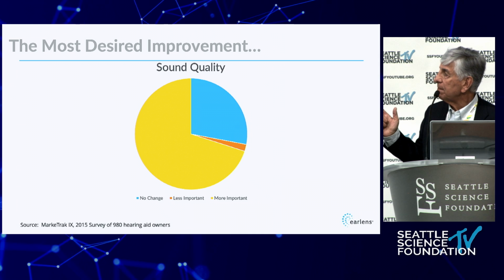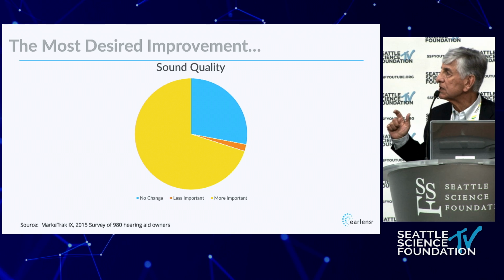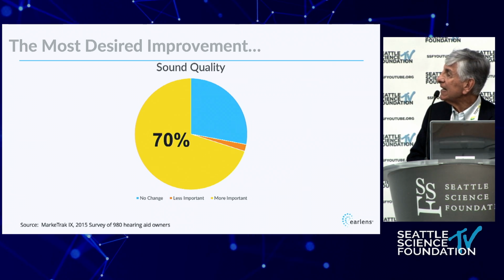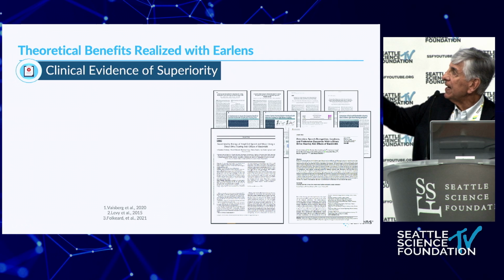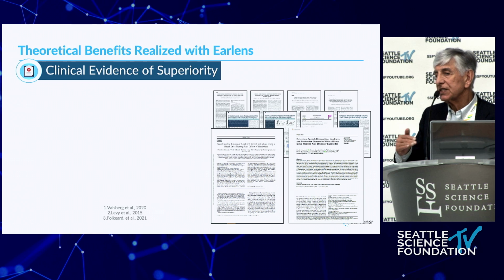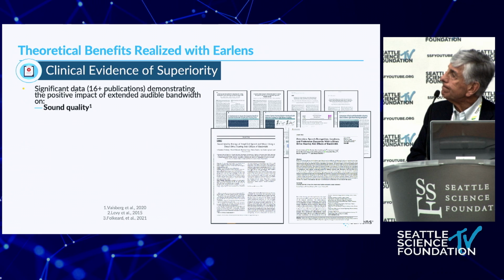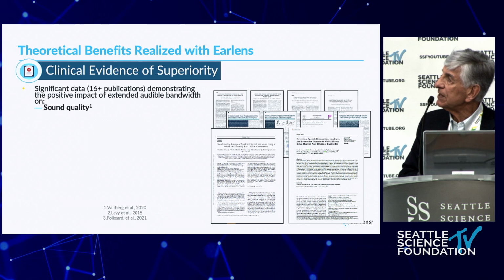If you talk to hearing aid patients, the number one problem they talk about with their traditional acoustic hearing aids is sound quality. Sound quality is very important to them. The second most common thing is having discrimination in background sound. There's plenty of evidence, and several articles have recently been written about different types of hearing aids and their bandwidth and how hearing improvement goes. But the purpose of my talk today is to show you that sound quality and hearing in background noise are important.